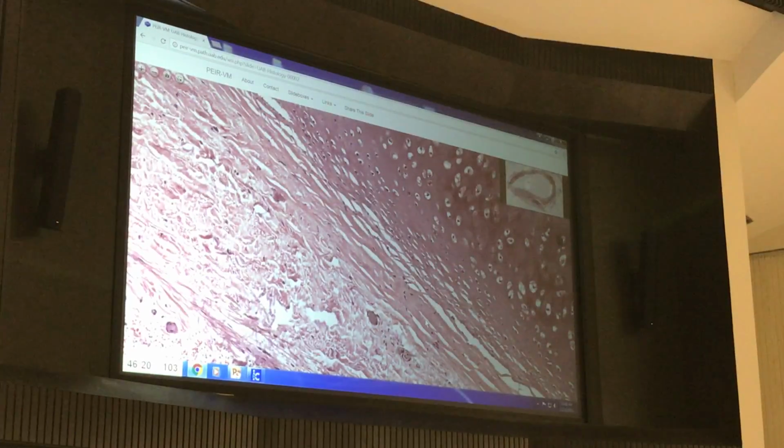Anything else? A good guide is, because these will all just be static images on your test, you can come on here and look around some more if you want. But if not, a lot of them will be very much like the pictures in my PowerPoints.